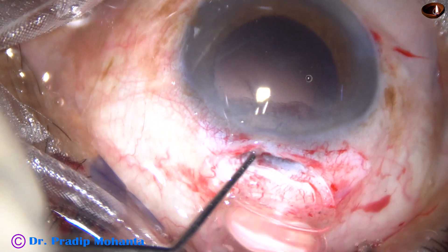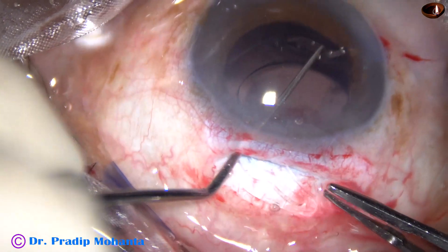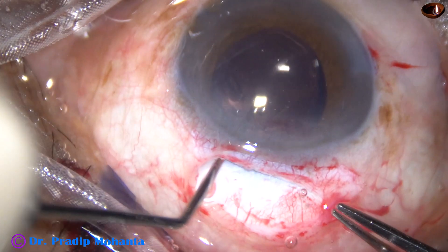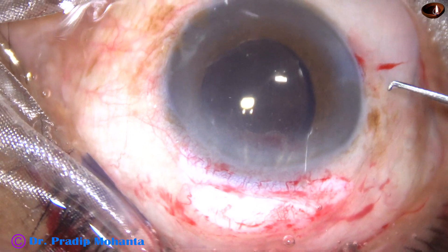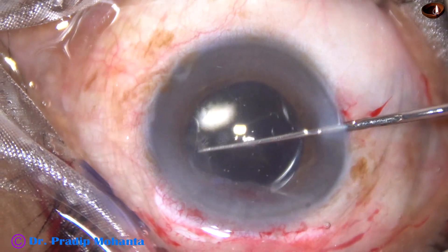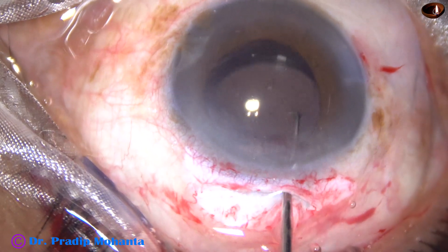This is how you can place a foldable lens using a Sinski hook through the main port. Once it is placed, it has gone into the capsular bag. But you can check through the side port. You can hook the rhexis margin and see if the edge of the lens is above the rhexis margin or below the rhexis margin.